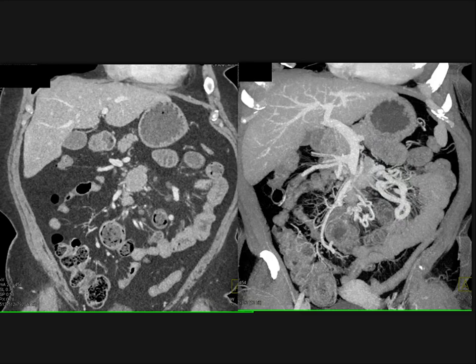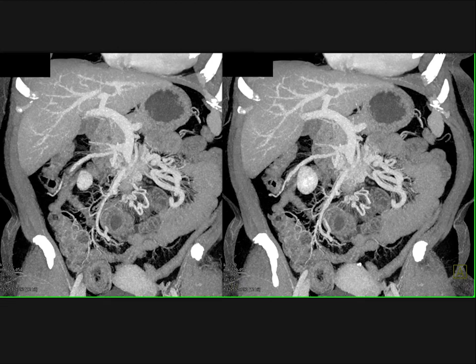It's not the polypoid lesion I showed you in the last bunch of cases. It's more of an infiltrating lesion. And you can see the mass in the mesentery here. Of course, that mesenteric mass is classic for carcinoid tumor. Now, the small ones in the duodenum I showed you did not have those mesenteric masses or local nodes. This one's not that large, but it's more infiltrating, and there's lots of nodes and this mesenteric mass.